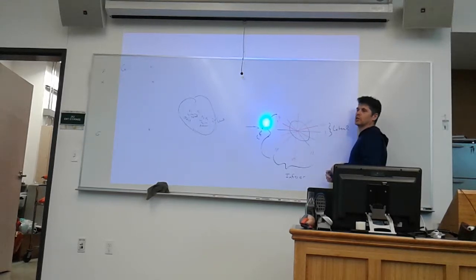What portion of the heart is not represented at all currently? Posterior. The posterior part of the heart is not represented. And we do have a lot of MIs in the posterior. There's a lot of muscle mass in the posterior. So they are not represented.